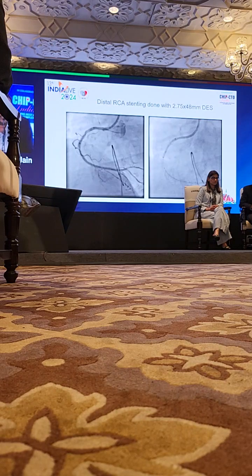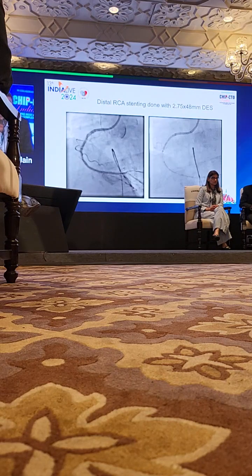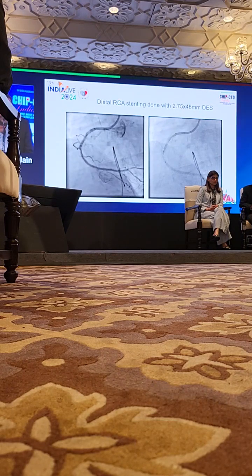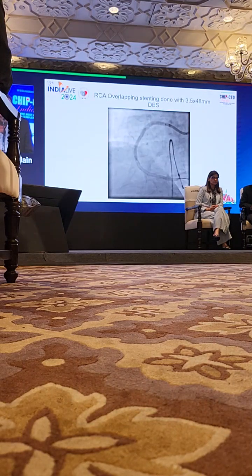The patient till then was totally fine, with no complaint, hemodynamically stable, and ECG was fine. Then I thought I would stent, starting with the distal part. Two long stents were needed because it was a totally calcified lesion. I stented the distal part with 2.75 by 48 and the proximal part with another stent of 3.5 by 48. Till then it was fine, and suddenly the patient became unstable.